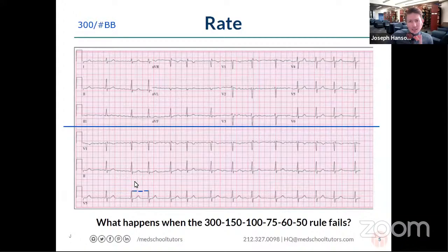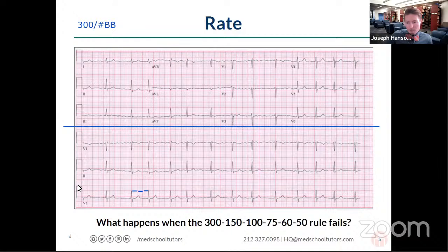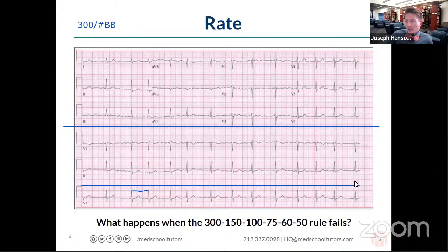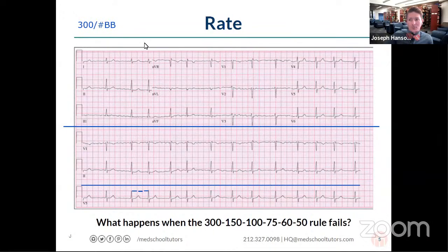One way we can measure heart rate is 300 divided by big boxes. But there's another way to measure heart rate using EKG based on the fact that this entire rhythm strip should be about 10 seconds in duration. If I know that this entire thing is 10 seconds, then if I count the number of beats and multiply that by six, I should have the number of beats in 60 seconds.